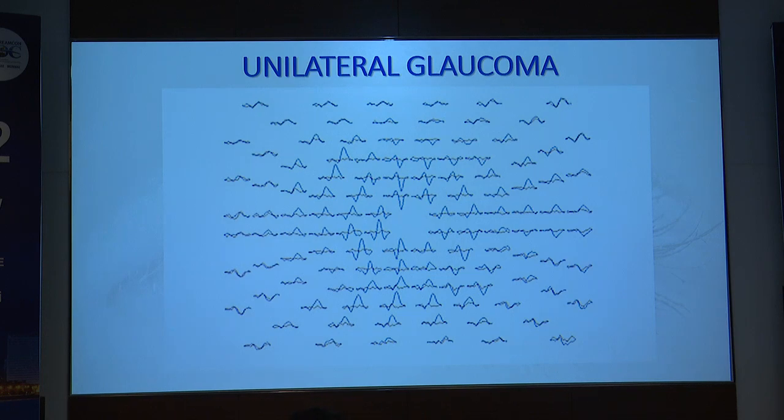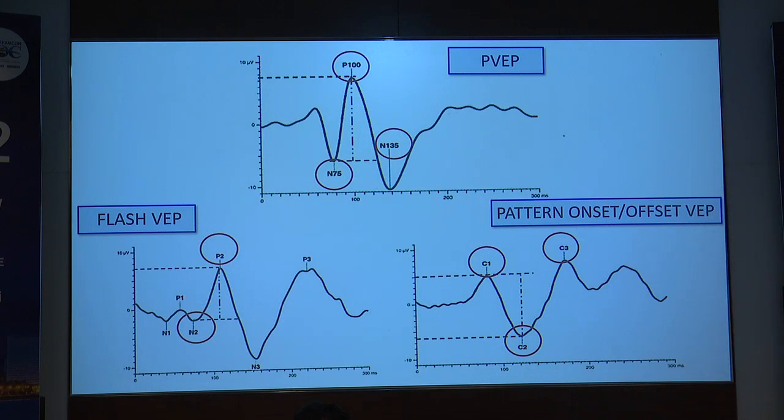This is the output in unilateral glaucoma. Just reviewing all the waves of all the VEPs.